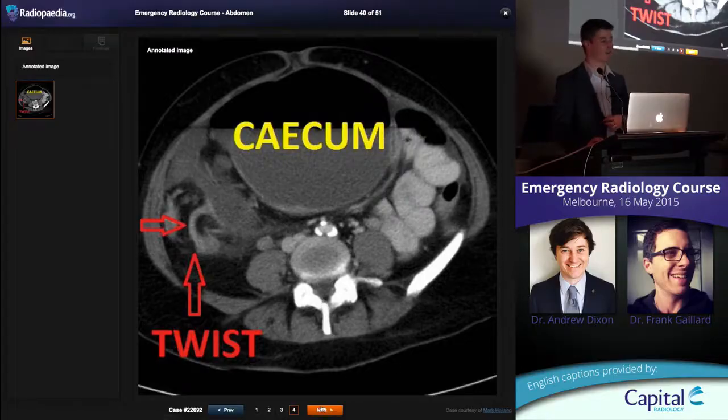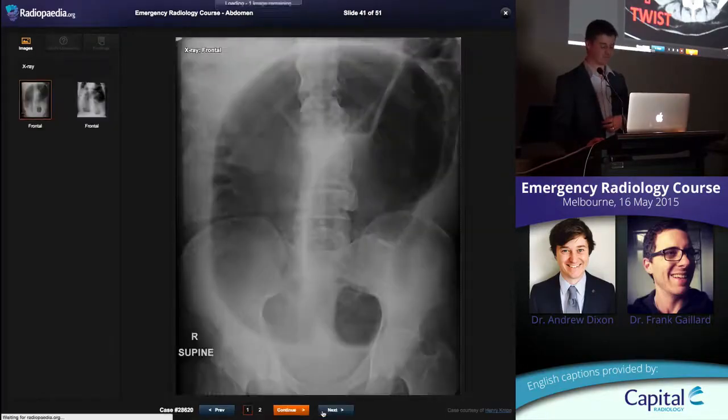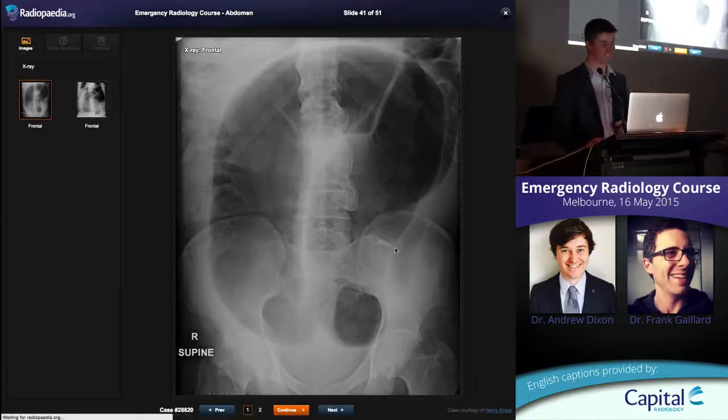So Mark Holland, very good annotated diagram. We should have that for every case.